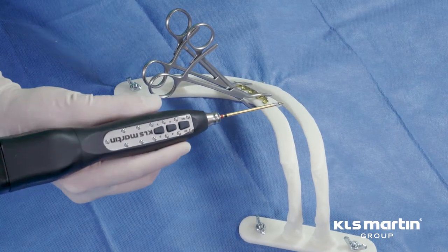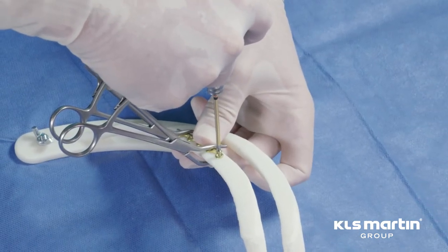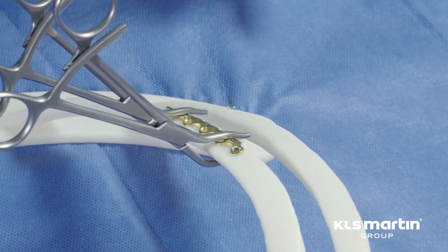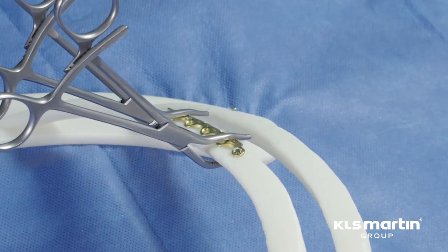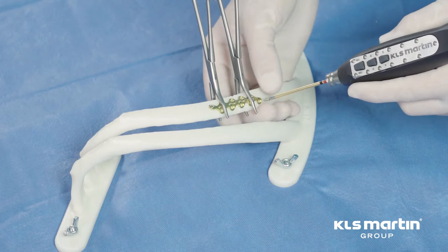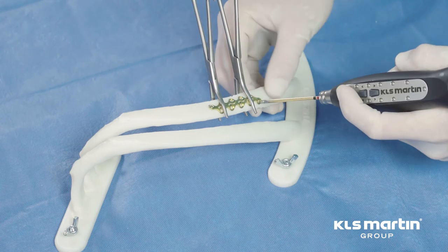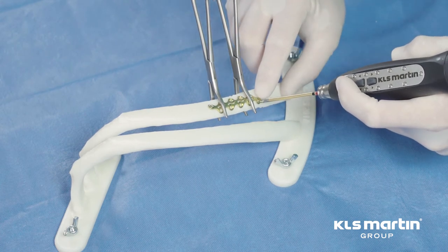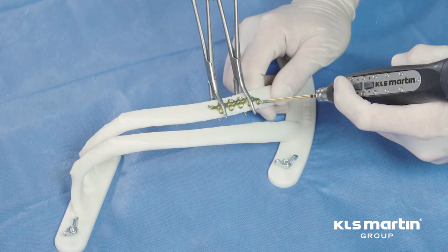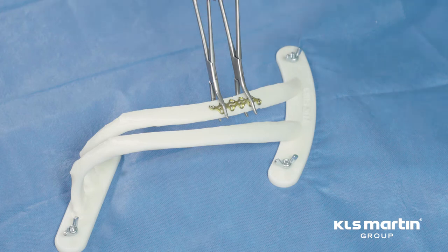This is the max driver — a torque-limiting screwdriver which allows rapid and reliable delivery of the 7-millimeter screws. I prefer to put in the peripheral or distal-most screws first, which makes it easier to readjust the plate if needed. The orientation is important. These screws are converging and there are small guides which direct the orientation of your screw. The torque-limiting nature of this screwdriver prevents over-tightening.